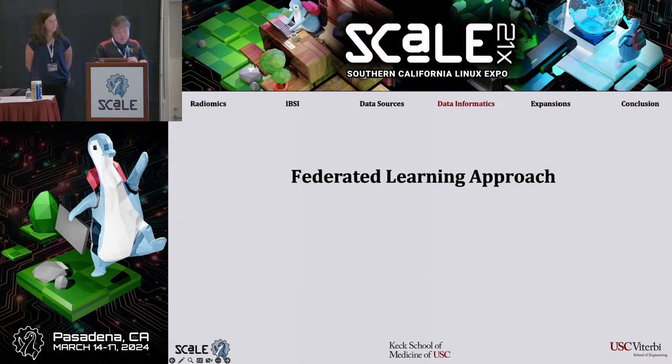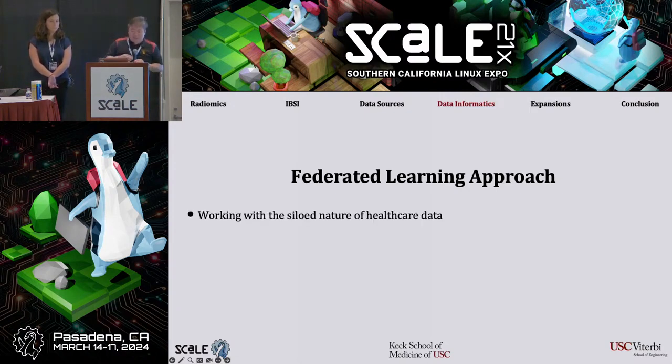One of the newer approaches, anybody here heard of federated learning? It's a concept that's gaining more traction, especially in the medical field. What it basically means is instead of moving data and then processing it in some place, you actually process the data in-house in the secure area, and then just send out the processed information for aggregation at a larger site level. Previously, the way you did medical imaging research was you used a central repository, everybody sent the images there, and then somebody did the processing, segmentation, and analysis, and came out with: we've done 5 different centers, this is the result.